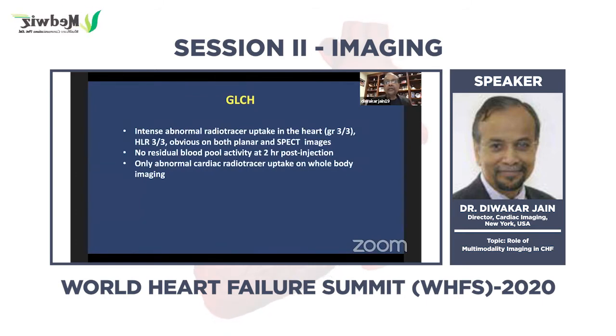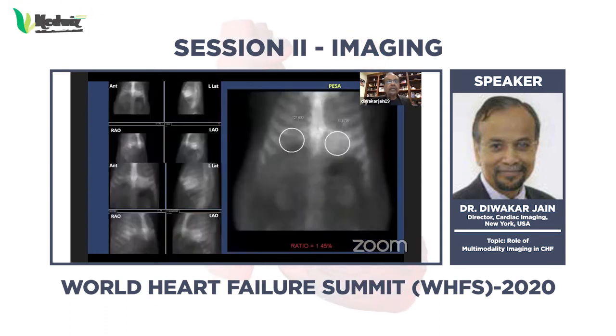And indeed, she was confirmed to have a diagnosis of TTR amyloidosis of the heart, and she has been started on a treatment which is available now, and we'll see how she does over a period of time. This is yet another example of a positive study, with a little bit less intense uptake compared to the last patient.